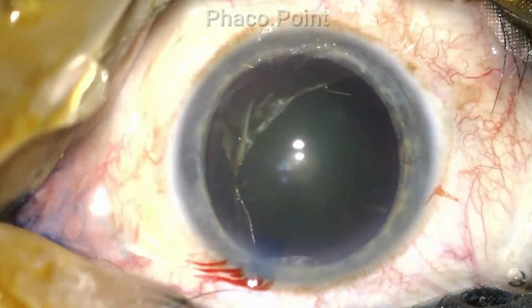Here's a case where I, the left-handed surgeon, while making my side port entry at the 2 o'clock position, created an accidental nick in the anterior capsule. So now the question is, where do we go from here? Typically, I would perform my rhexis from my main incision at the 1 o'clock position. Now this seems rather awkward.